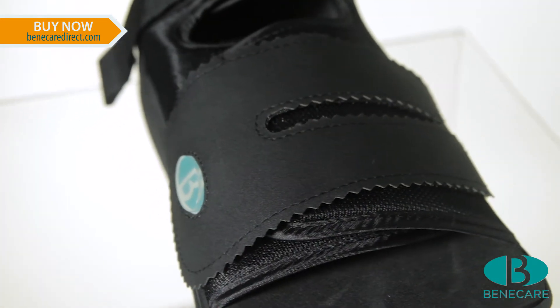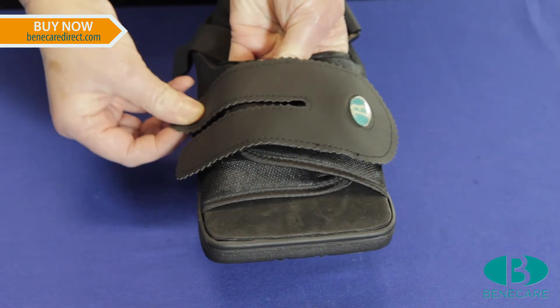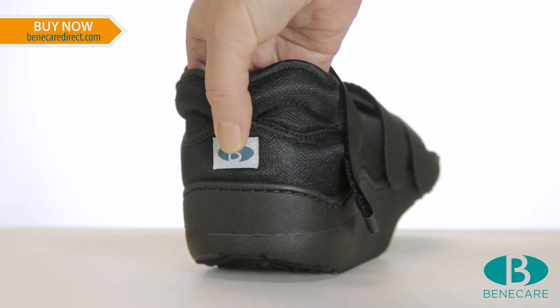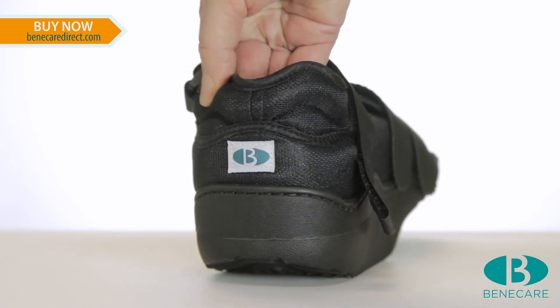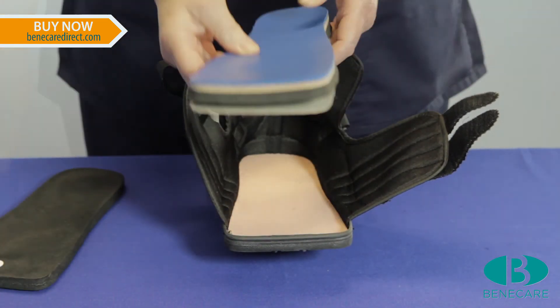The removable forefoot closure provides excellent support whilst eliminating buckle pressure. The heel of the shoe has a reinforced heel counter to provide stability of the ankle and a padded collar for added comfort and protection. And the insole can be removed to fit a bespoke manufactured insole.